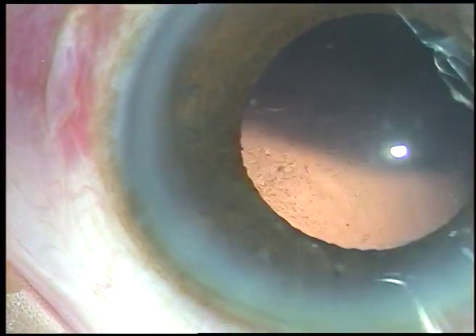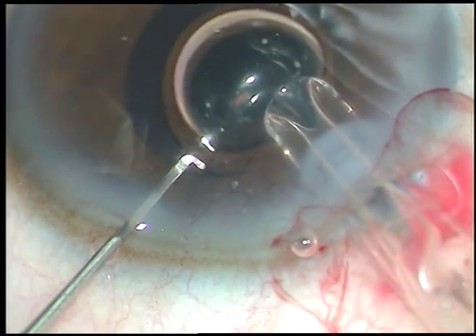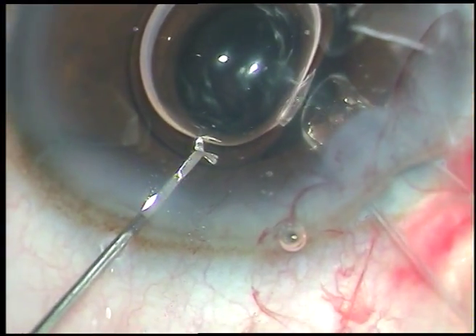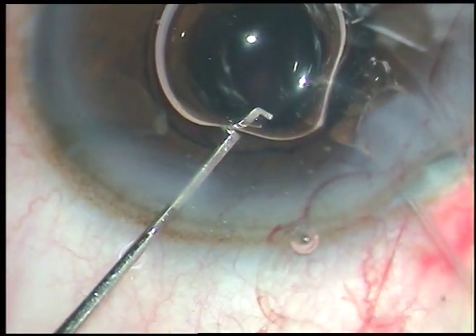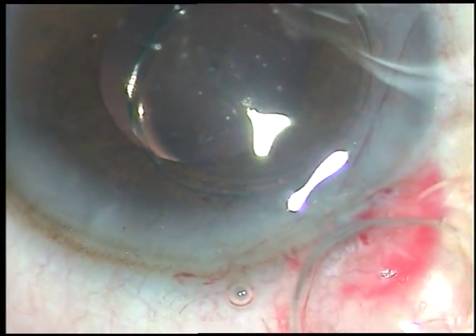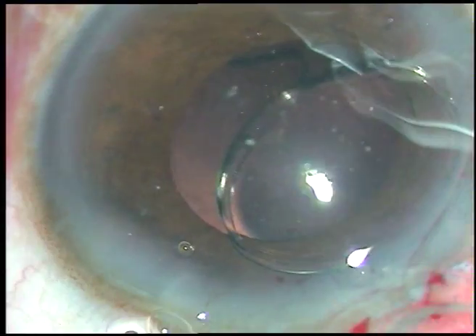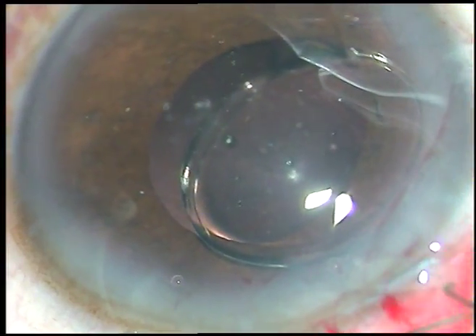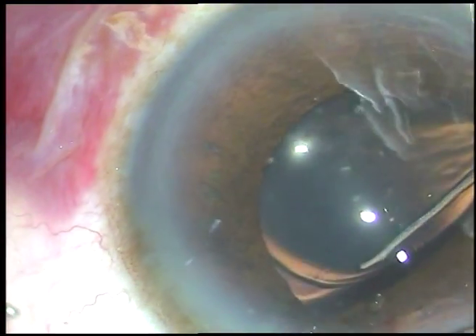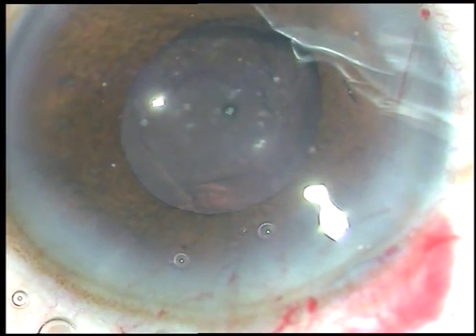After injecting viscoelastic substance, I am injecting a Hanita lens. There was some air bubble in front of the lens that has gone into the eye, but I am sure I will be able to place the lens in the bag. Some portion of the lens has already gone into the anterior chamber so I cannot come out — I have to inject the lens in the bag. I placed the chopper through the side port to support the optic so it does not come up and hit the corneal endothelium. I then used the Sinskey hook to place the lens in the capsular bag.